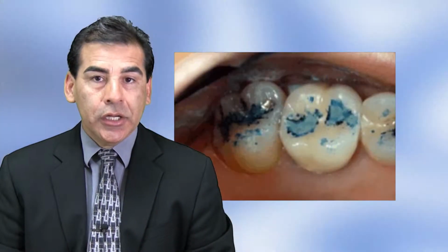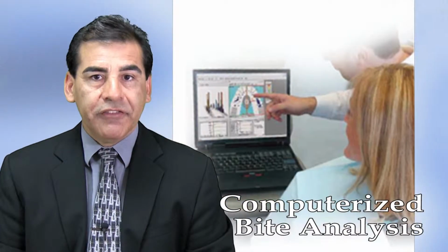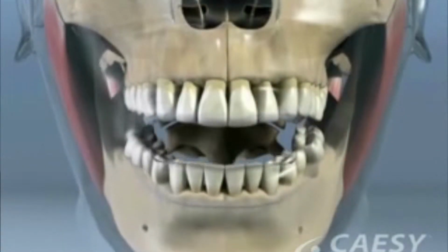The way in which teeth touch largely determines the jaw's position in the TMJ. So instead of traditional ink markings on static teeth, I evaluate a patient's bite with a T-scan. The T-scan is a diagnostic device that identifies and records patients' bite force dynamics, including occlusal force, location, and timing.